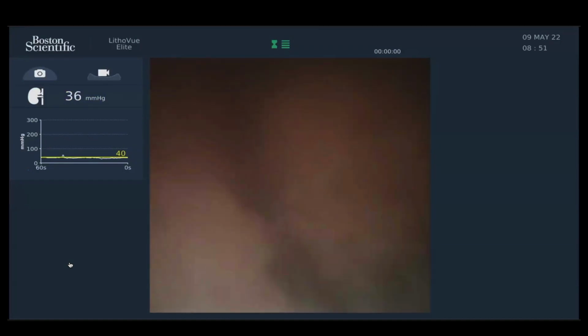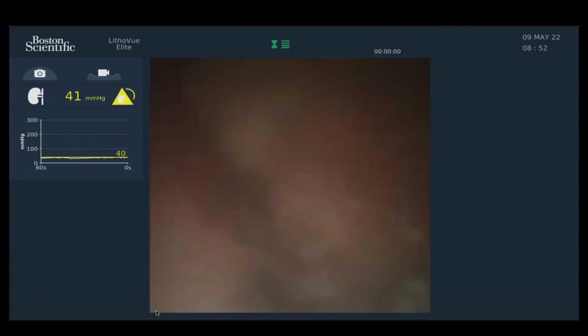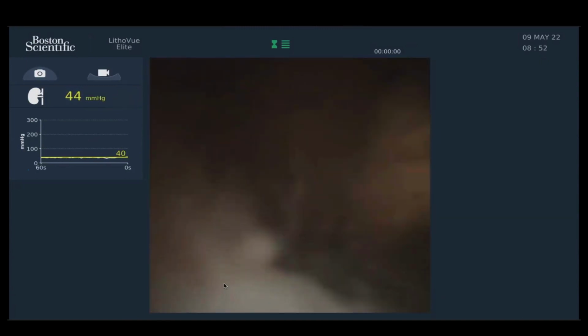But I can't. As you'll notice, the pressures keep going higher and higher. Let me forward the video a little bit here. Basically, the pressures keep going higher and higher the more we treat the stones. Again, the imaging is not perfect, obviously. So we're up around 40 now.